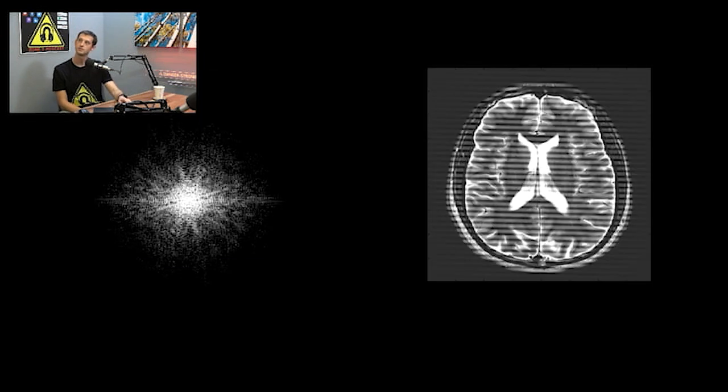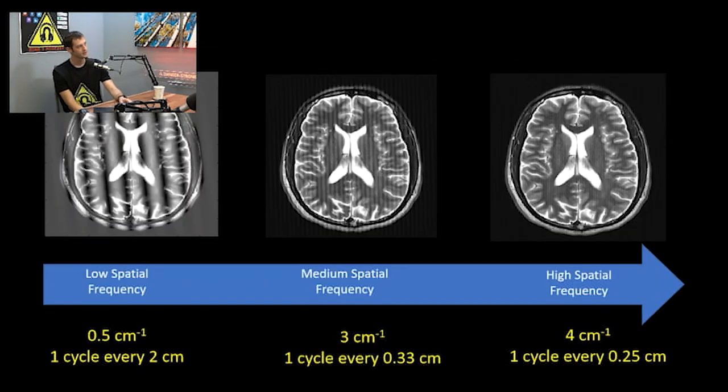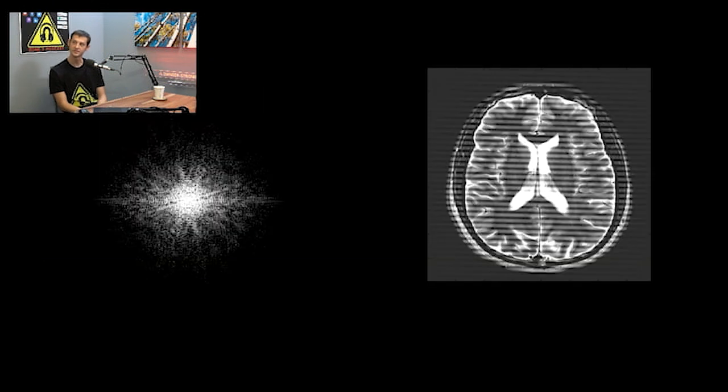And what parameter would you adjust to make that happen? Yeah, that is your idea of spatial resolution. As you increase the matrix size, you normally think of it as adding more image pixels. But on the acquisition side, you're actually adding more K-space encoding positions. And as you get a bigger and bigger K-space, you're capturing higher and higher spatial frequencies. Nice. Next slide. So this is the vertical lines.